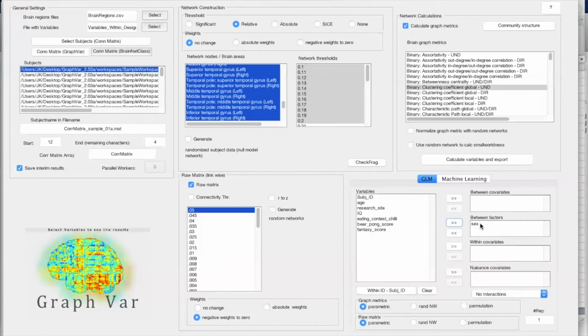This essentially means that we compute a difference measure for each of the groups, as we previously just did in the other example, where we are not interested in any group difference, but just want to see whether an intervention was successful or not. So in the end, what we'll have then is a difference value for the 2 time points, T2 minus T1, for the males and for the females.